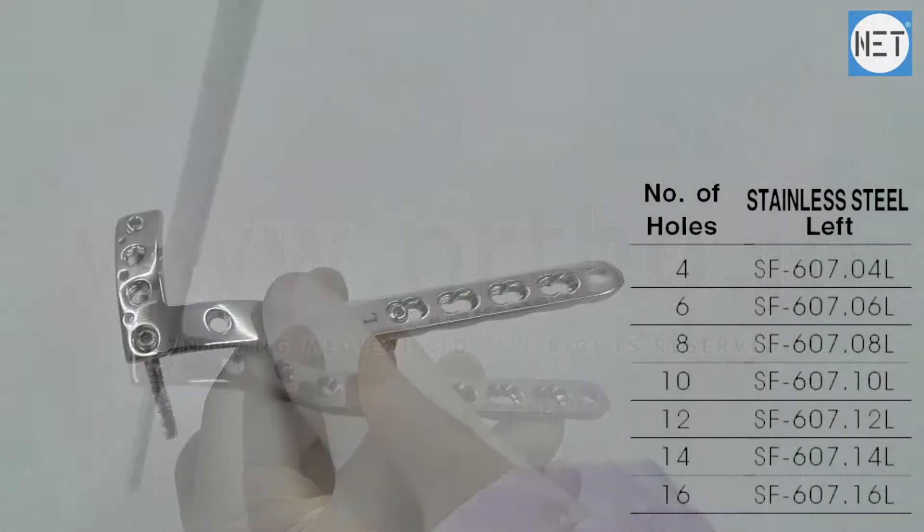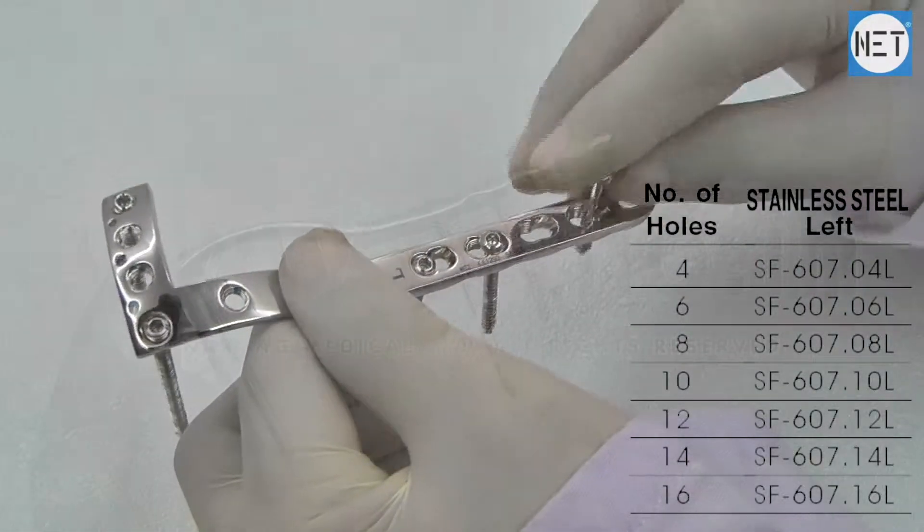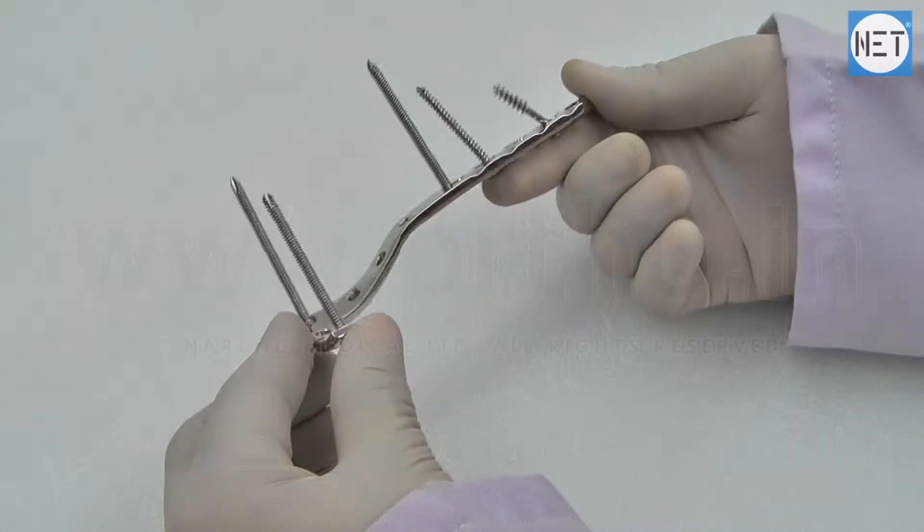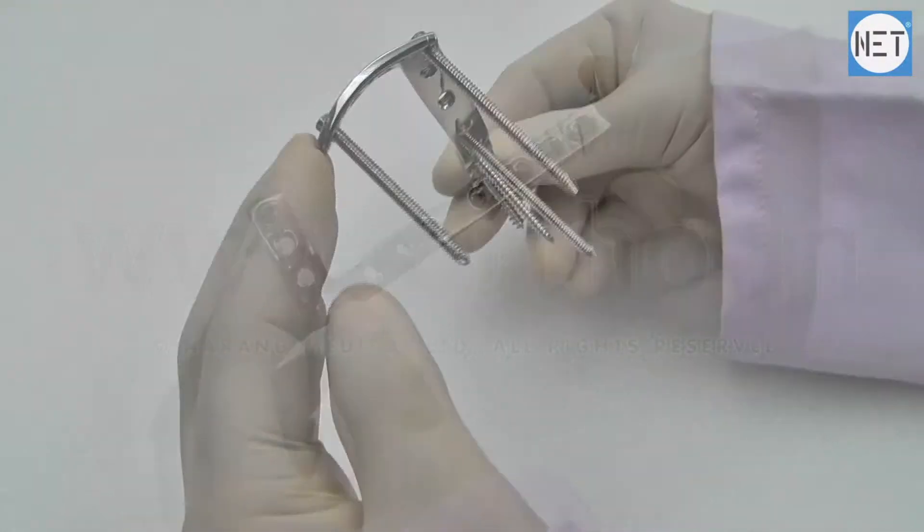These plates are available with number of holes varying from 4 to 16 and are designed for both right and left tibia. These are available in stainless steel and titanium.